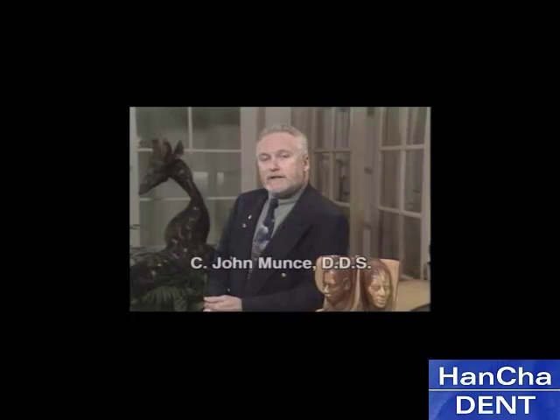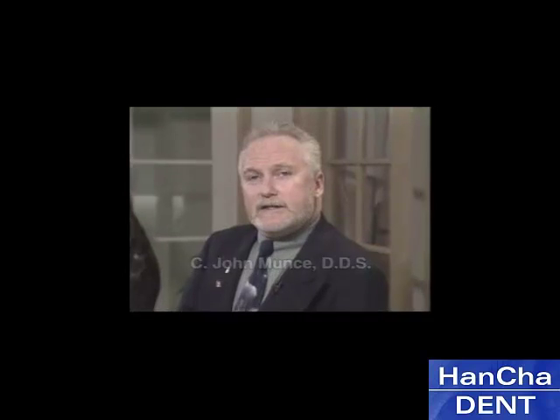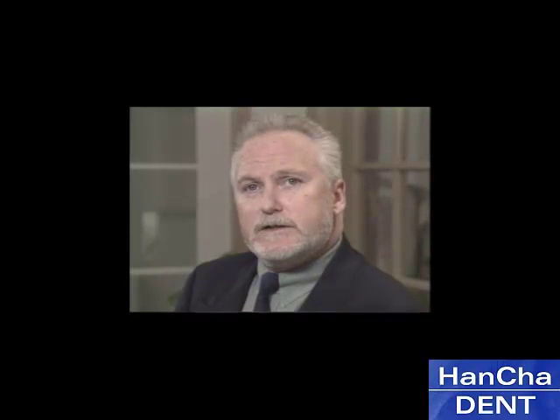Over the next few minutes, I will introduce you to a new concept, a technique, and a simple product, the projector, which can dramatically alter the way in which you perform endodontic procedures.